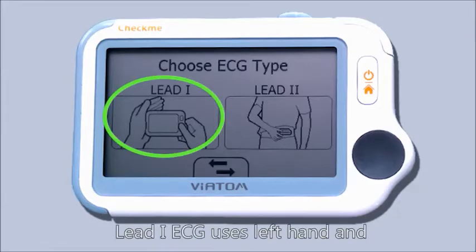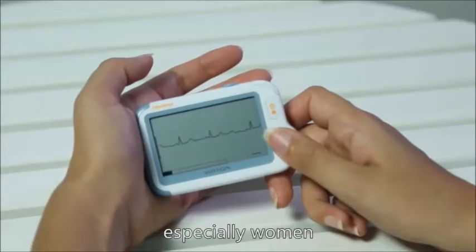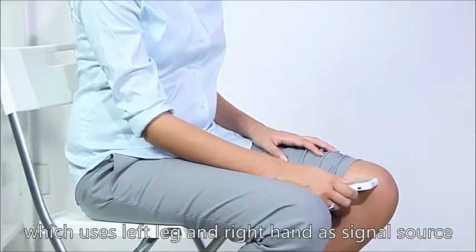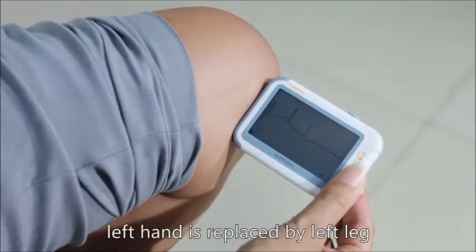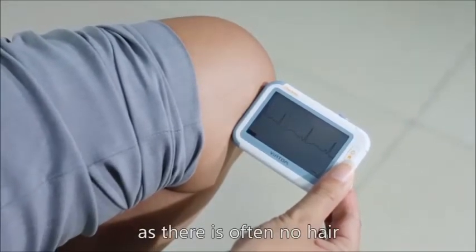Lead 1 ECG uses the left hand and right hand as its signal source. Almost 10% of people, especially women, have low amplitudes of lead 1 ECG. Larger signals can be obtained from lead 2, which uses the left leg and right hand as signal source. For lead 2 testing, the left hand is replaced by the left leg. You can choose the left knee as the contact area, as there is often no hair.